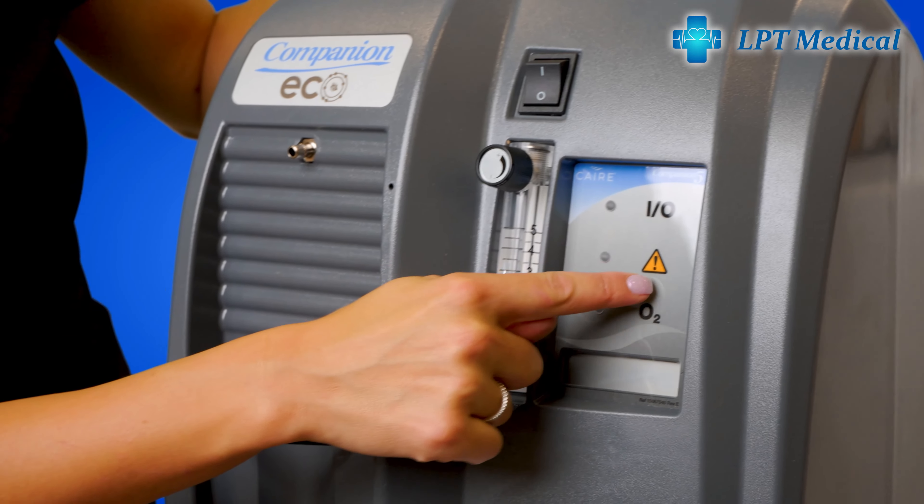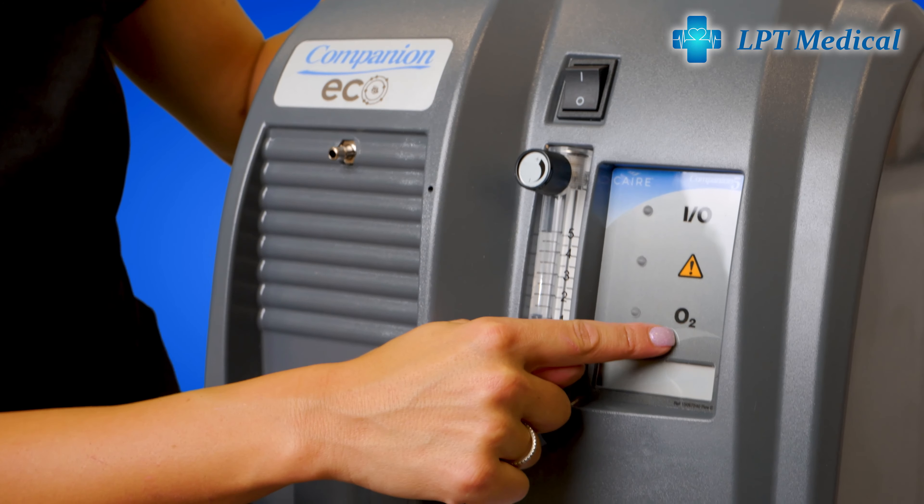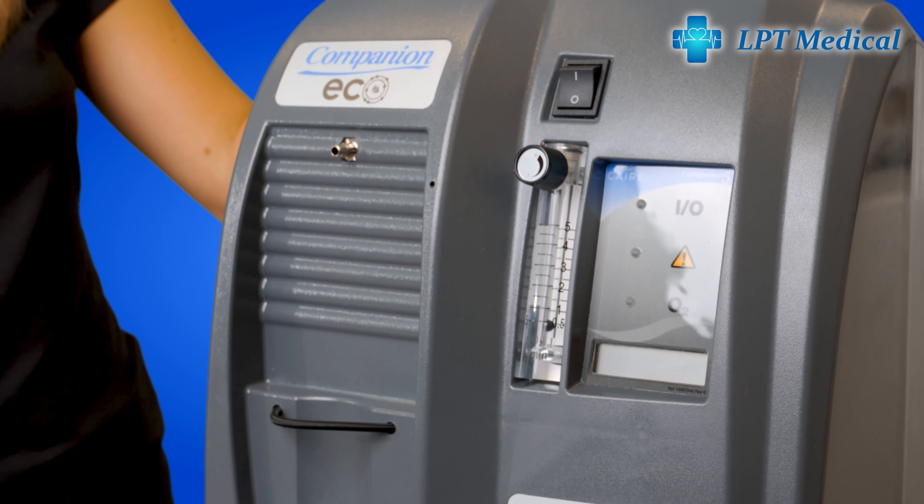This light will come on when the power is on. This light will come on if there are any warnings, which you can refer to your user manual for. And this light will come on if the O2 purity is lower than it should be. And this right here is for the hours of use on your machine.